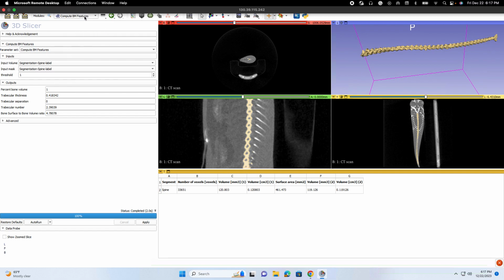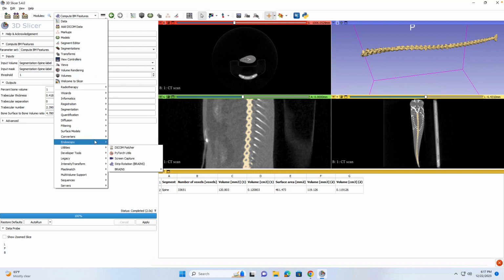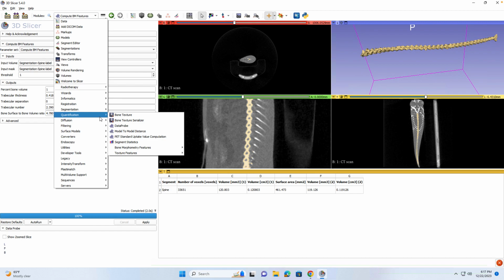Next, we'll get into the Mac Daddy, the pinnacle of 3D bone statistics, which is going to be these GLRLM features. Pretty much the way to describe these is, imagine you have pictures of different spines, like x-rays, and you want to understand how the properties of these spines change. In this scenario it's in CTs, especially when they're treated with oil. That's just an example.